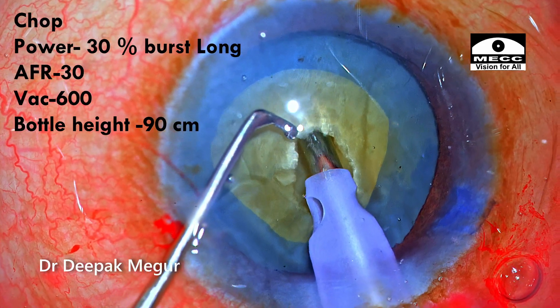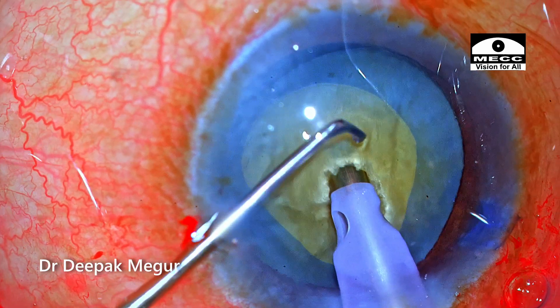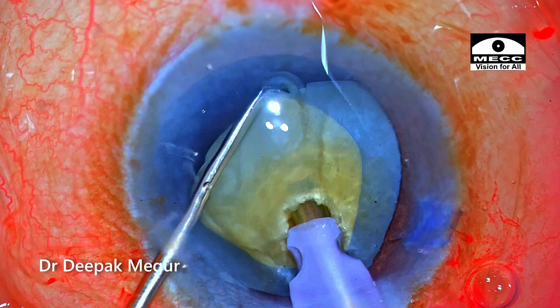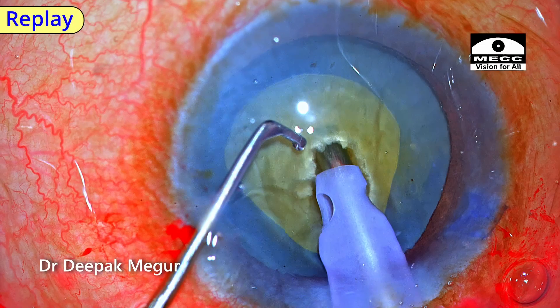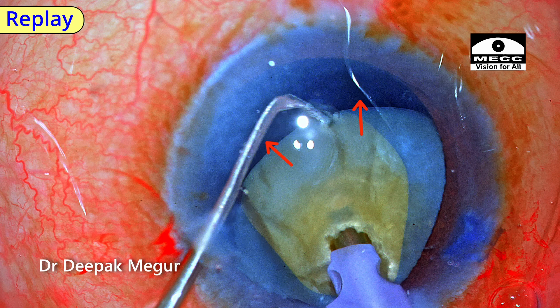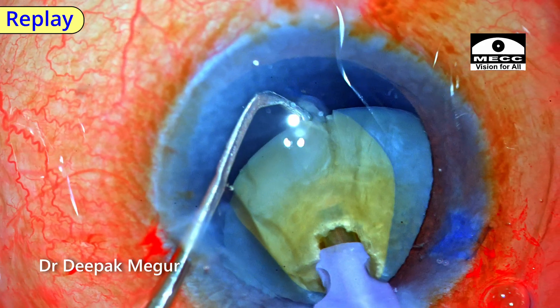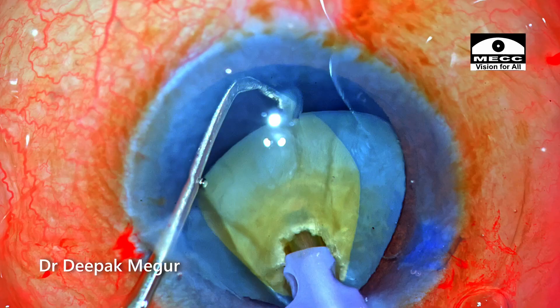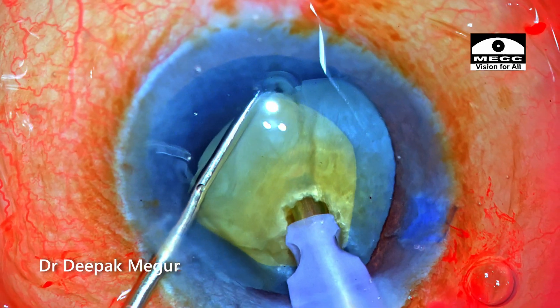As I bury into the nucleus and pull it centrally, the chopper goes and hooks the equator of the nucleus under direct visualization. I'm pulling the nucleus towards me to access the endonucleus, tilting it up to ensure the tip of the chopper is far away from the posterior capsule, and then the horizontal chop is performed.